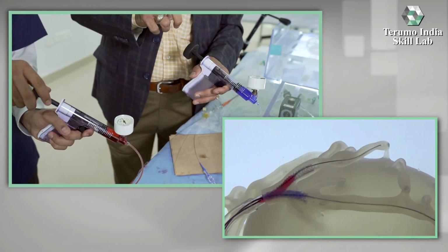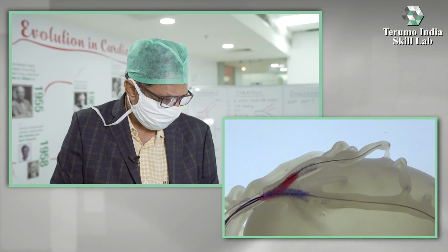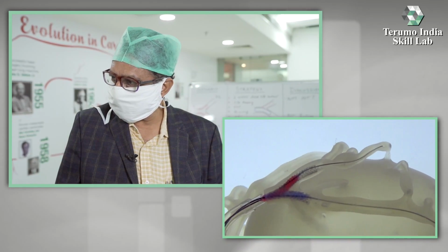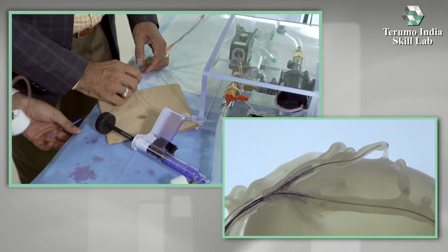So this is the final kissing balloon, the second kiss, to optimize the result at the bifurcation. So it also optimizes side branch ostial and proximal dimensions. Your main branch is already optimized when we deployed at about 14 atmospheres. We did a POT on the main branch with a 4 mm balloon, and we'll do a final POT with a 4/6. Okay, so our procedure is complete.